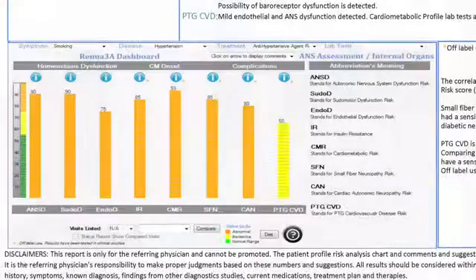The first measurement is the ANSD, or Autonomic Nervous System Dysfunction Risk Factor. This can better be defined as a stress assessment, because this data point measures the patient's response to the various stresses that occurred during the testing. Blood pressure, pulse, and sweat measurements are obtained while the patient is standing up, deep breathing, at rest, and during a Valsalva maneuver. If the patient is a very anxious person and has a lot of epinephrine in their system, the risk score will be much higher when being asked to complete these simple actions.